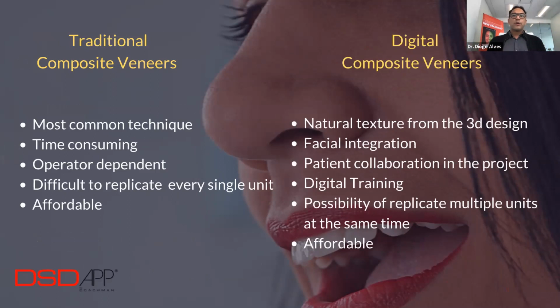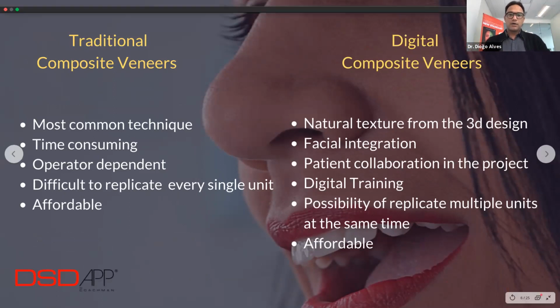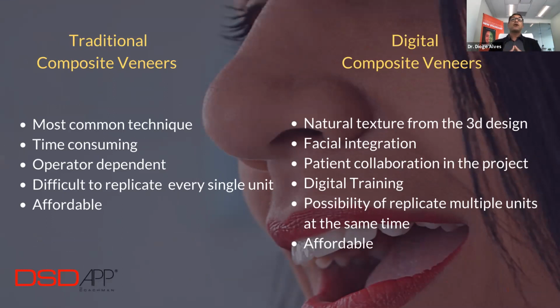When we talk about composite veneers, we all know it's the most common technique that we do in our office, right? But sometimes it becomes time consuming when you do 6, 8, 10 composite veneers. And it depends on the hands of the operator, on your capability of creating those composites.